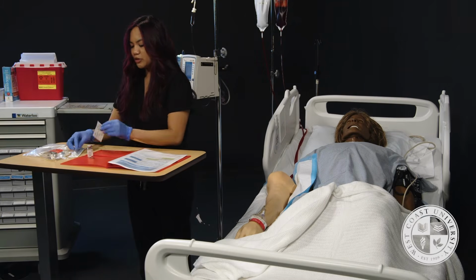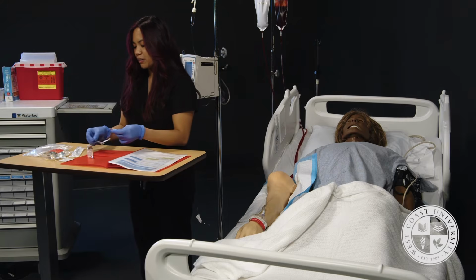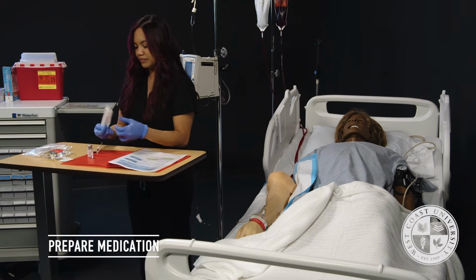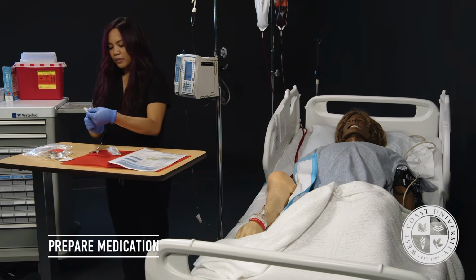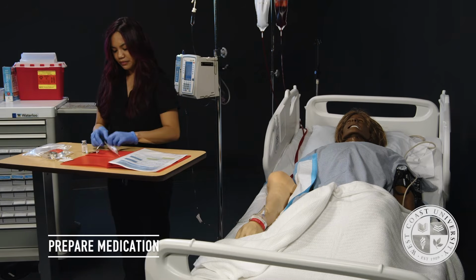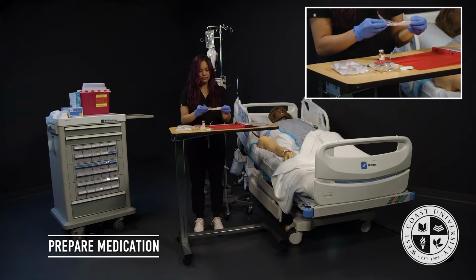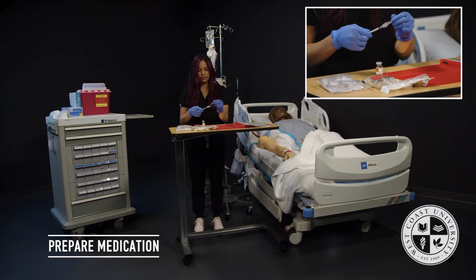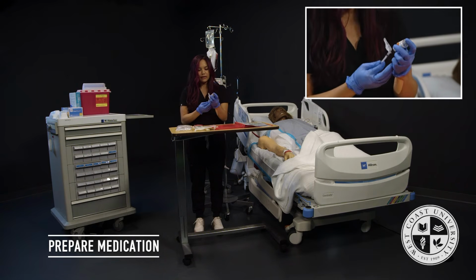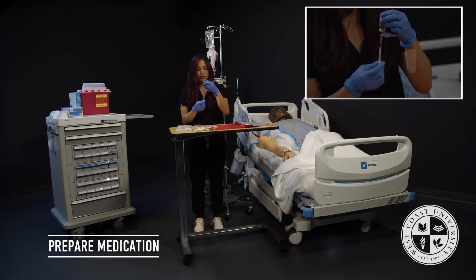At this time, I'm going to prepare my heparin, in which I will be giving 5,000 units. I went ahead and grabbed my heparin needle. I'm going to go ahead and grab my heparin vial. I'm going to be pulling 5,000 units, which is 1 milliliter. I'm going to go ahead and inject my vial and draw my medication.